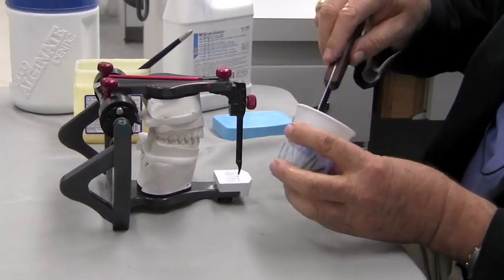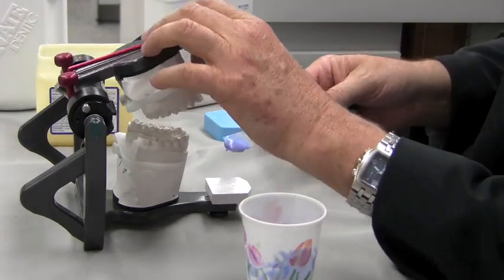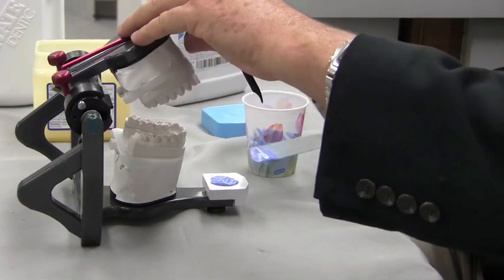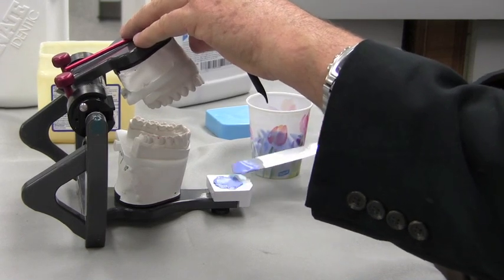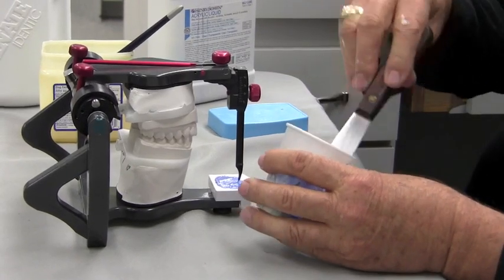What I want to do while I have it in this loose configuration — it's far too runny to work with right now — I'm going to put just a little bit on my table here and spread it out. This is so it bonds really well to this plastic. I want to make sure that this does not come loose. So while it's loose and running, I'm going to put a little bit on there.